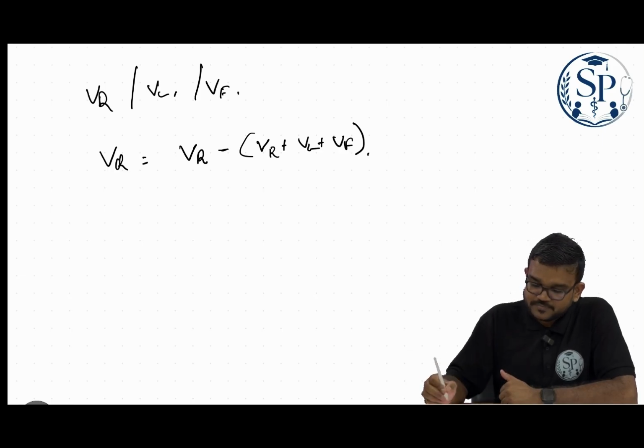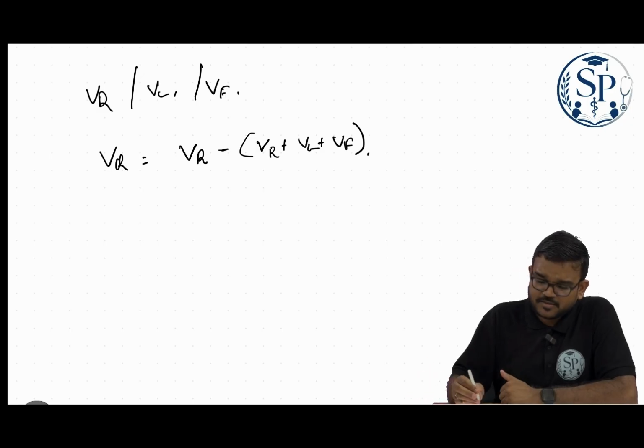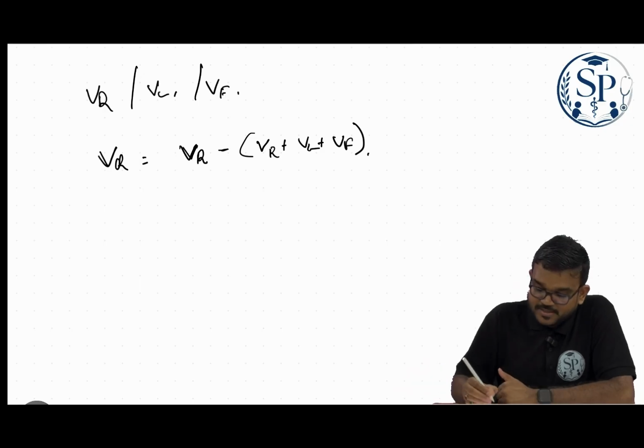Okay, so after this recording, the potential recorded is so minimal that it literally records no recording. So that's why it has been augmented.